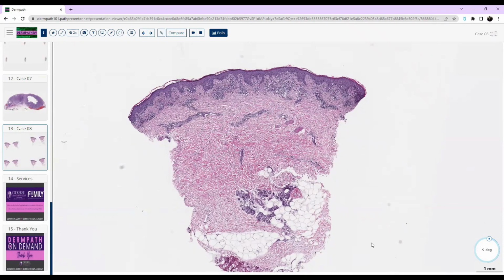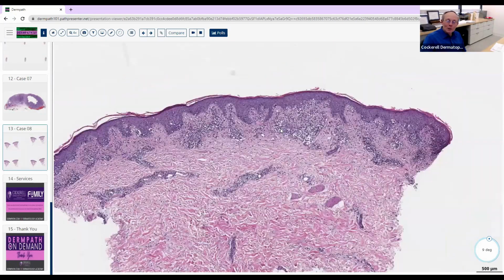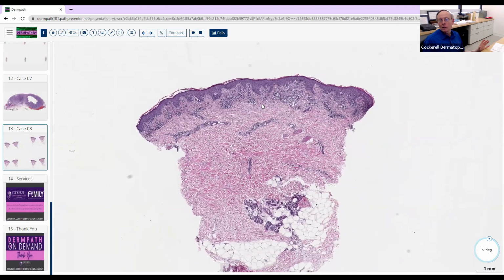I think they're neoplastic cells. All right, so what kind of cells do you think they are? Well, I think they're atypical lymphocytes. Ah, so it's kind of a trick question. So those are inflammatory cells gone bad, right? Yes, correct. So we'd say it looks like it's a process with inflammatory cells. Now, okay, so you thought they were atypical lymphocytes, but before we go to higher magnification here, do they look atypical with this power to you? No, they don't.